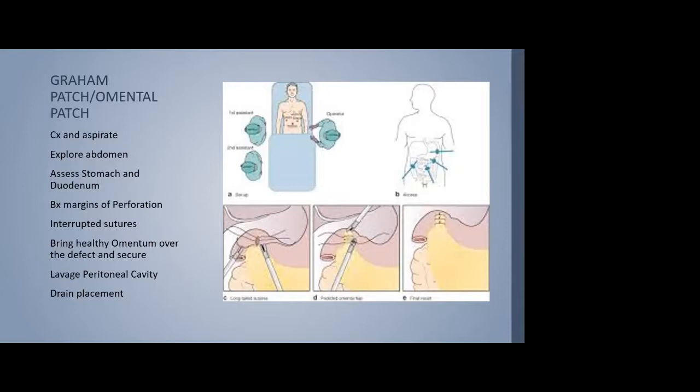I talked with Dr. Robick about that, and he led on that maybe it's more of the surgeon's inclination. I get in there, I see this ulcer. Do I think it's encroaching on 2 centimeters but the margins aren't looking very good? Maybe I should appreciate this as a larger perf versus a smaller perf in deciding to do a Thal versus a Graham. But for this gentleman, we'll move forward with a Graham patch.